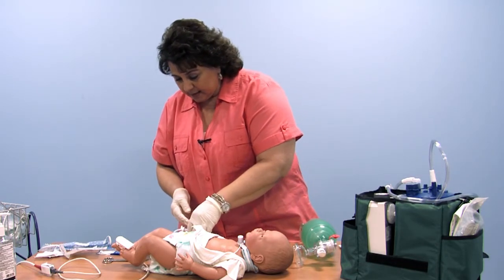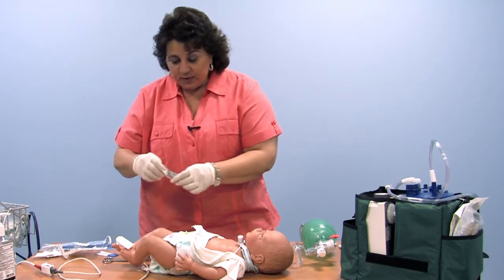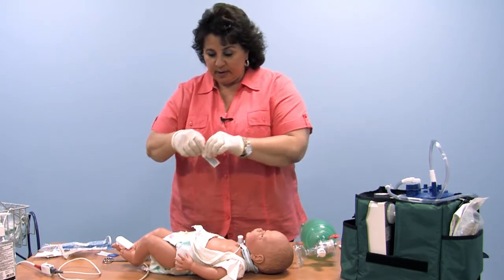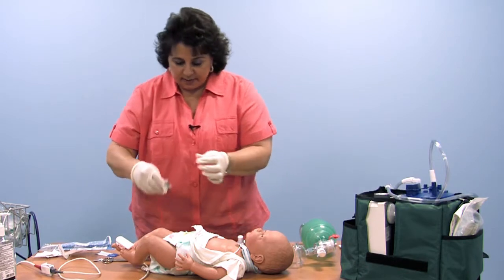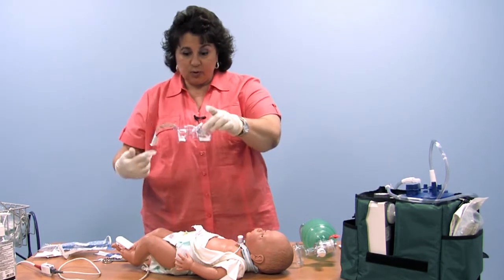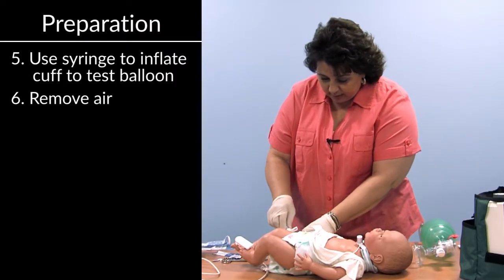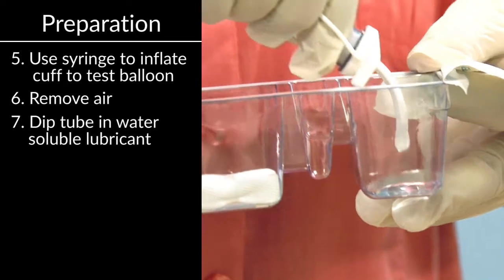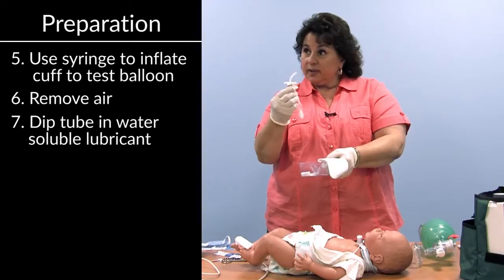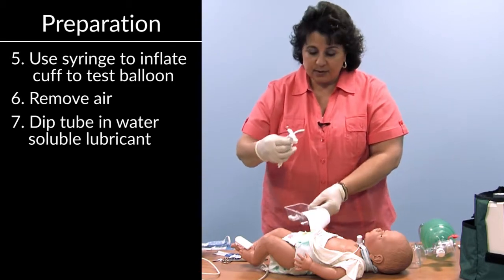And I'm laying it in its original sterile package. Then I will take a packet of my water-soluble lubricant, drip a little bit into my sterile tracheostomy tube container, and dip the tube in the end. Don't need too much, just a little bit at the end of the tube so that it will easily slide in and out of the stoma.